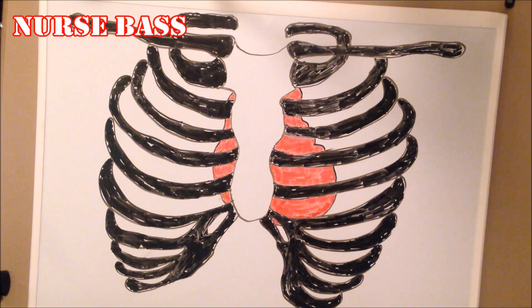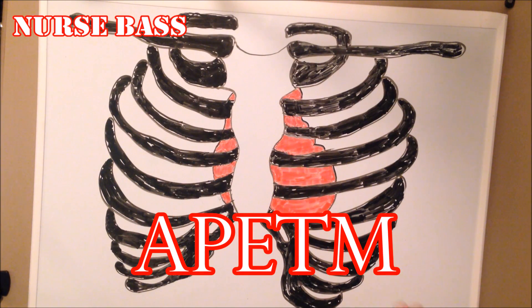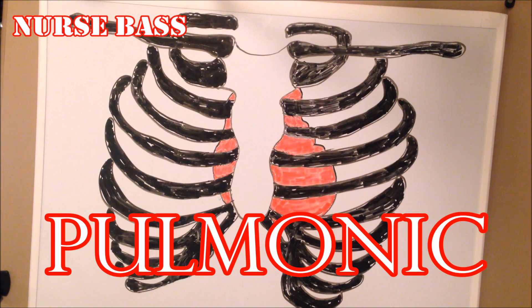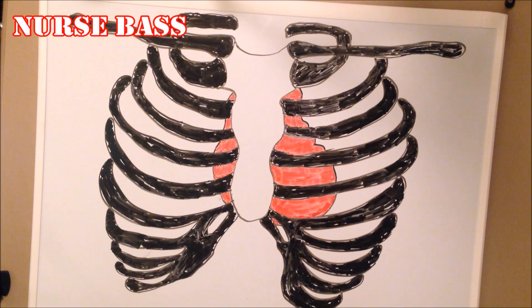I'm a nursing student, and here's how we're taught. You've all heard if you're in nursing school: A, P, E, T, M — Aortic, Pulmonic, Erb's, Tricuspid, and Mitral. That's the sequence in which we assess the heart sounds of these patients.